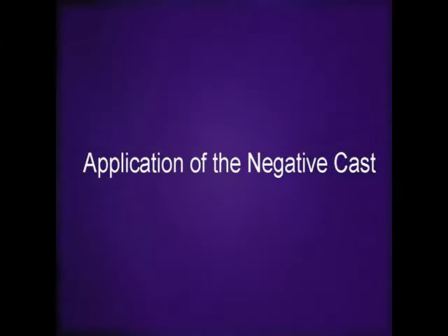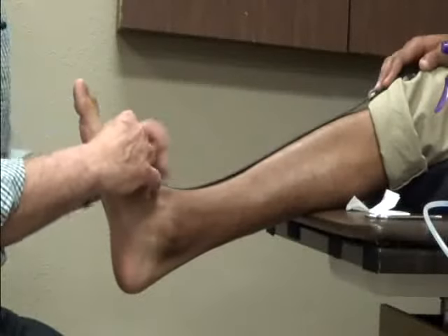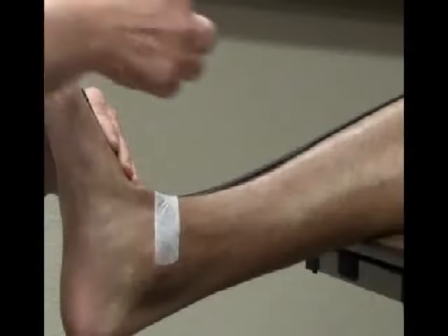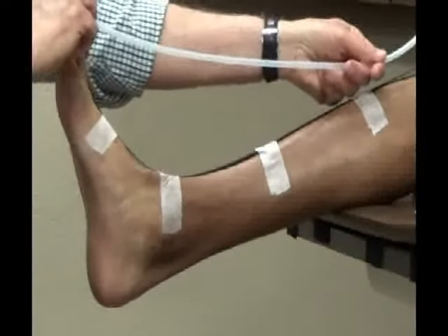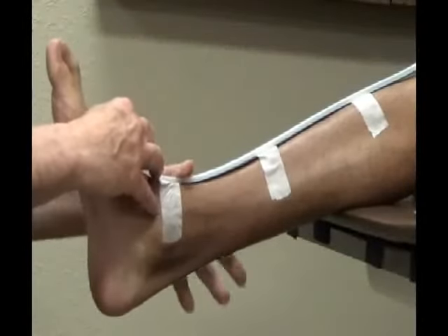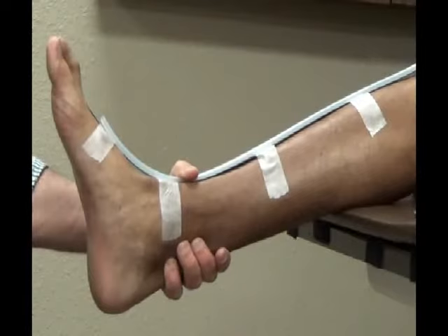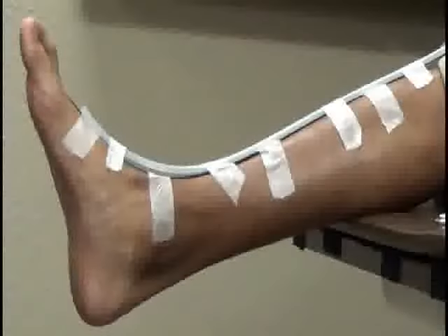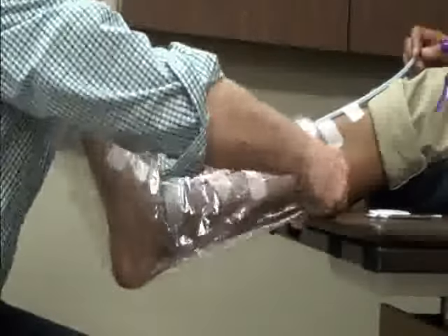Now that you're sure the foot can be properly positioned and you're familiar with the patient's position, take the protective strip and, using the paper tape, apply it to the dorsum of the foot starting at the web spaces of the toes and extending all the way up to the anterior aspect of the tibia. Next, take the tube and place it one half of an inch distal to the protective strip and also apply paper tape to hold it to the anterior aspect of the leg. Next, apply the plastic bag and be sure to push most of the air out.